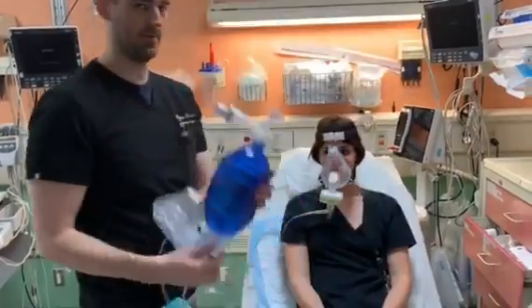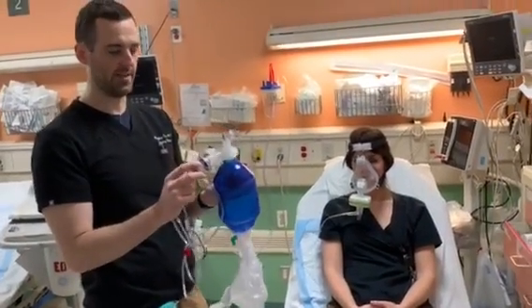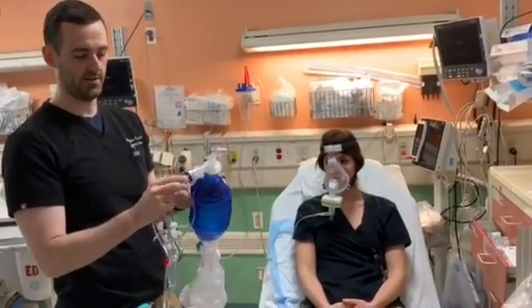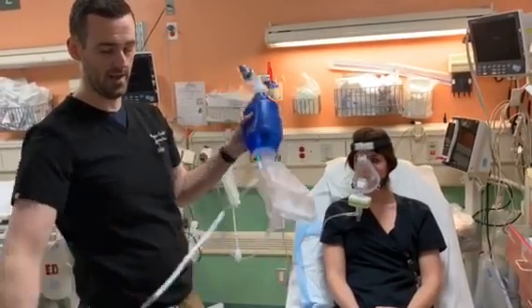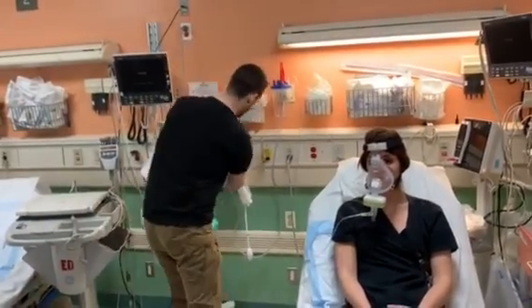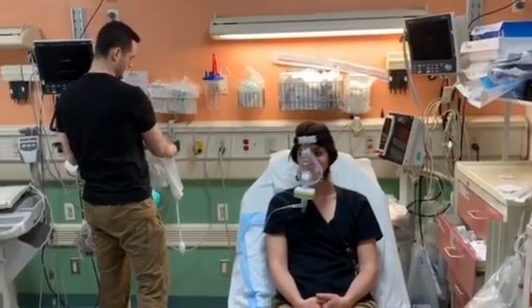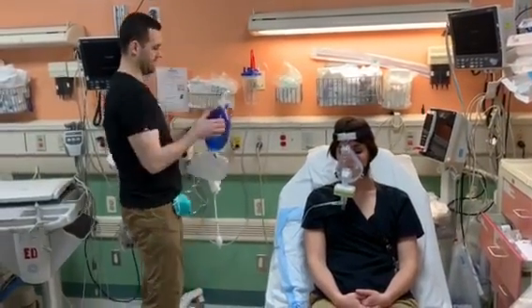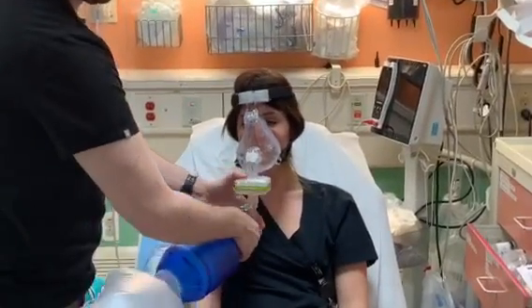The most important part is going to be the BVM, which I already attached to a PEEP valve. They all have a PEEP valve already attached, which you can set to whatever you want. They're all set automatically to five, but you can go up and down as needed. You're also going to attach this to the oxygen — crank it all the way up. This just spins on the bottom, and then you're all set.